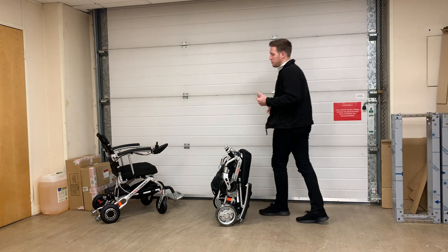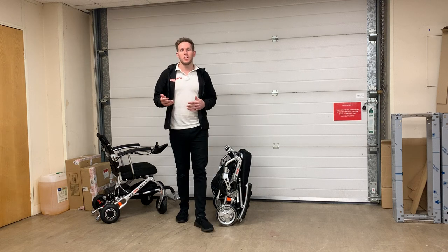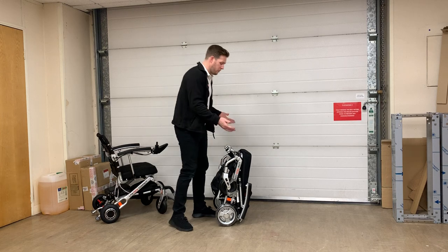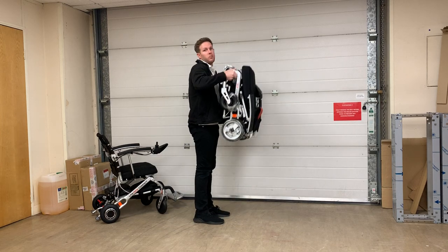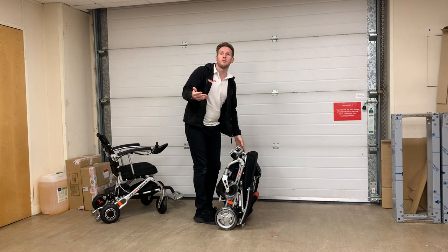A good example of this is my mum. She's 68 years old, literally five foot nothing, weighs about eight and a half to nine stone, and she can literally pick the chair up by its legs and stick it straight into the boot of her Ford Fiesta, which obviously has quite a small boot.